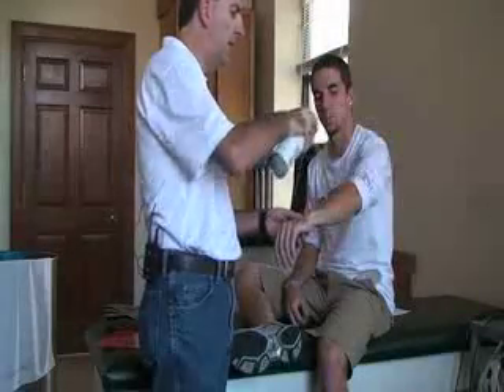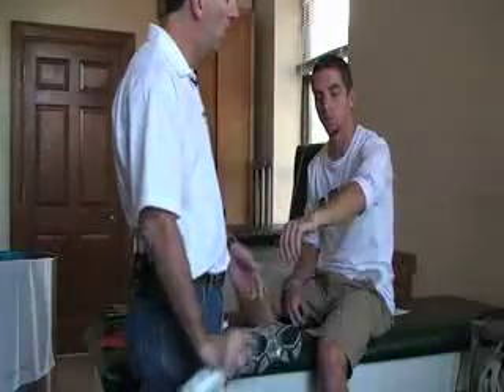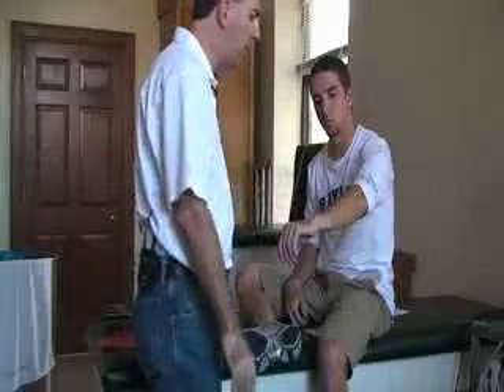Also ask him if he feels any discomfort during this time to let you know so that you can stop the treatment. And then that should stay cold for a while.